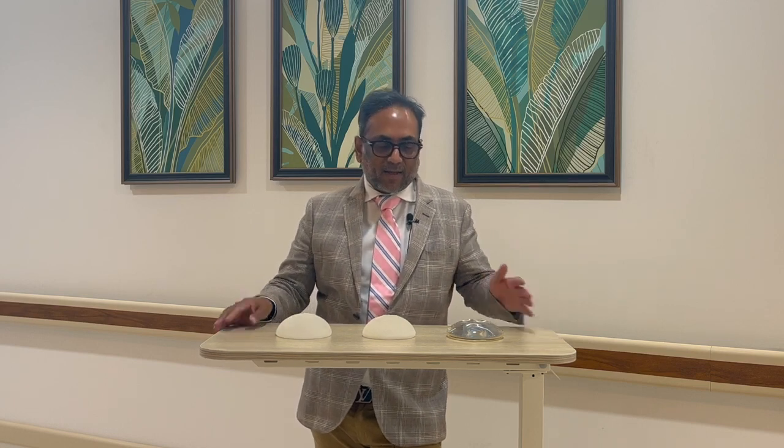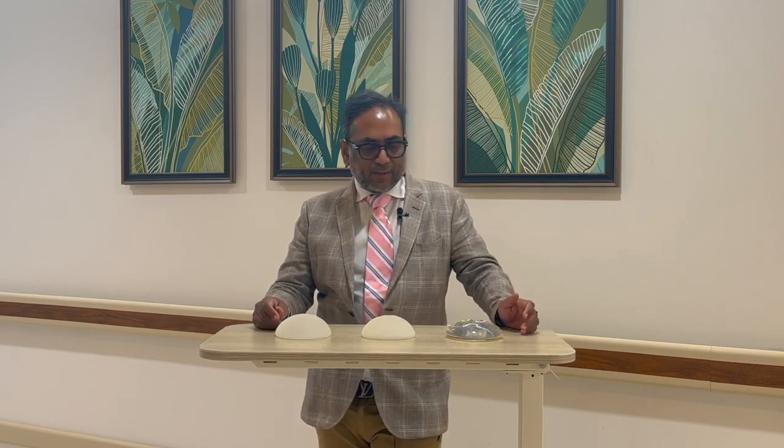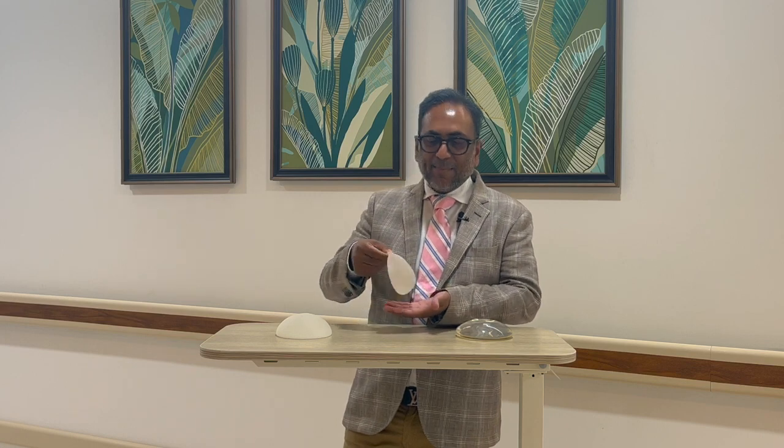The gold standard in breast augmentation or enhancement is using silicone implants. What I have in front of me are various implants. You can see that this is a round shaped implant, and you have this which is an anatomical implant. We'll talk about these, and you have various texturing of surfaces of these implants, which we shall talk about a little later.